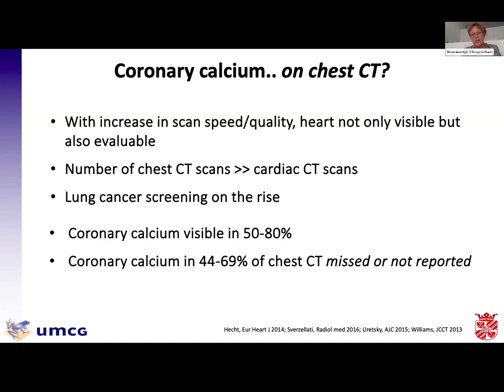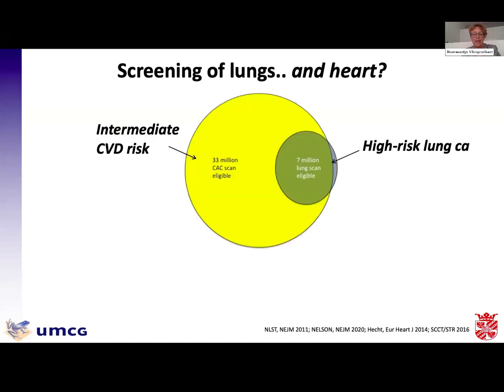From previous studies, we know that coronary calcium is actually visible in 50 to 80% of chest CTs, but in 44 to 69%, this is missed, or at least not reported on the chest CT scan. So this is, I think, a teaching point for all of us.